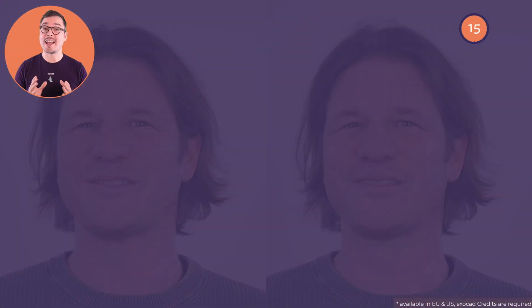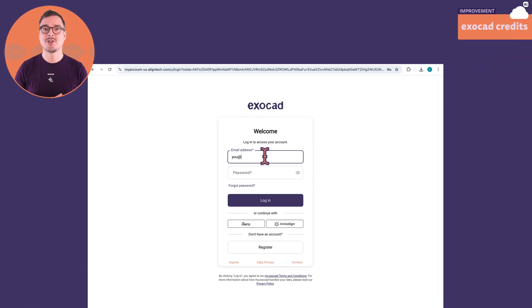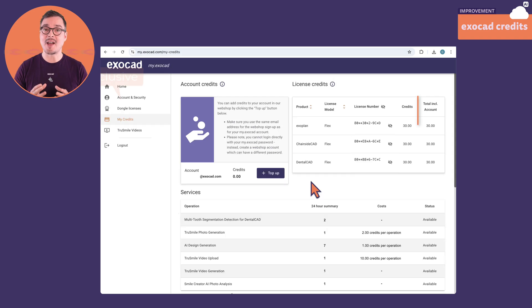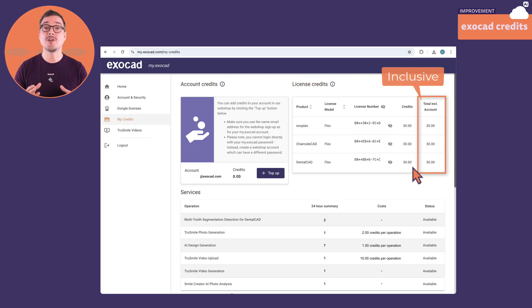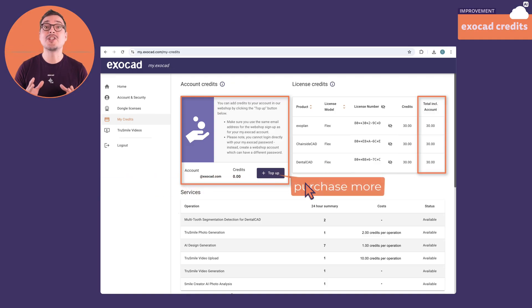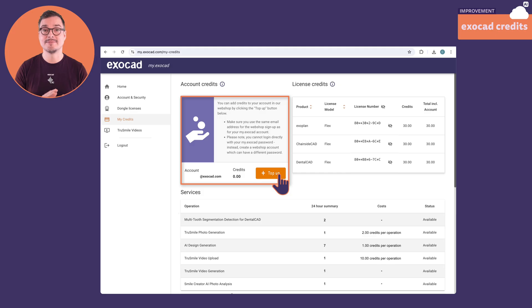You can start right away. At the beginning of each month, your Exocad license may get a bunch of free credits depending on your type of contract and location. After you spend your free amount, you can top up your credits on myexocad.com by purchasing more if needed.